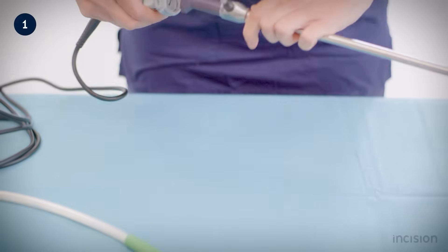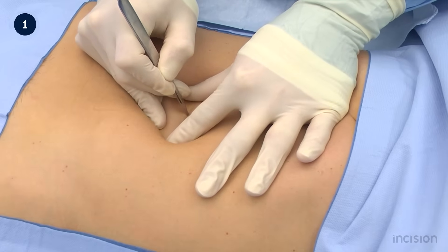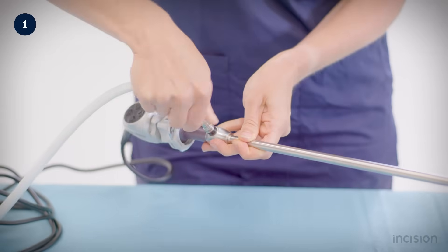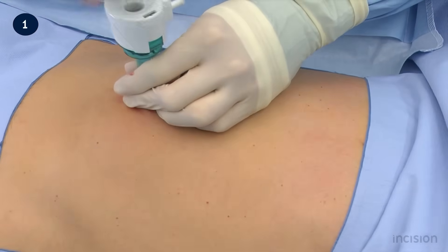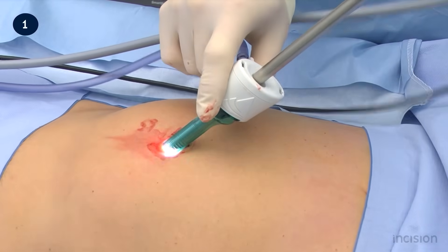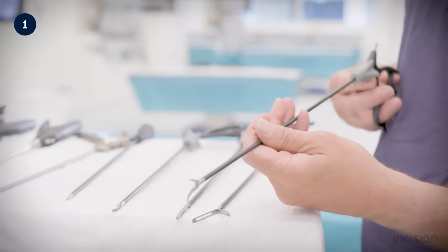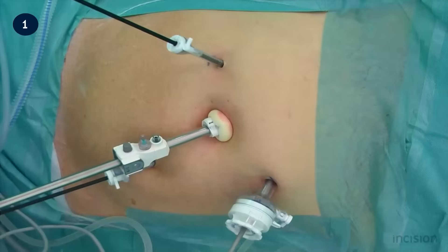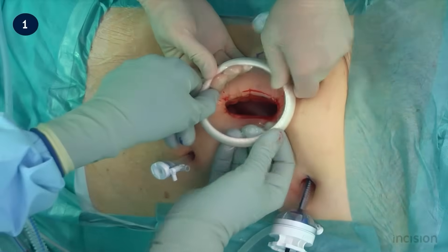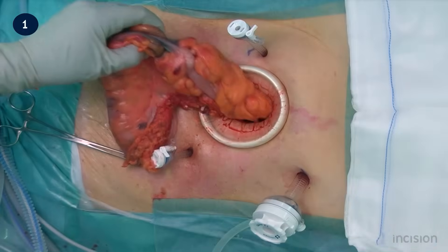Laparoscopic surgery is a term used to describe surgical procedures performed using one or multiple small incisions in the abdominal wall, in contrast to the larger incision of laparotomy, and is based around the introduction of a specialized type of endoscope through ports placed in the abdominal wall in order to allow the surgeon access to the abdominal pelvic cavity. Internal structures can be illuminated and visualized, and with the use of specialized laparoscopic instruments, tissues can be manipulated and procedures performed according to principles of minimally invasive surgery, a broader term used to highlight the benefits that, when correctly indicated and performed, this type of surgery can offer over traditional or open procedures.